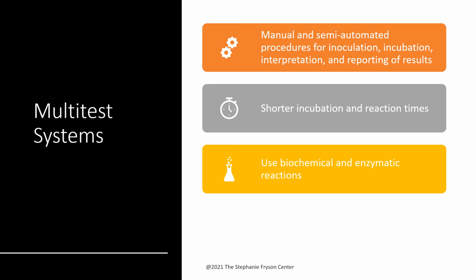So the multi-test system uses biochemical and enzymatic reactions. For those of you doing chemistry, you're going to have to know a lot of the enzymatic reactions, so you should get used to that now.